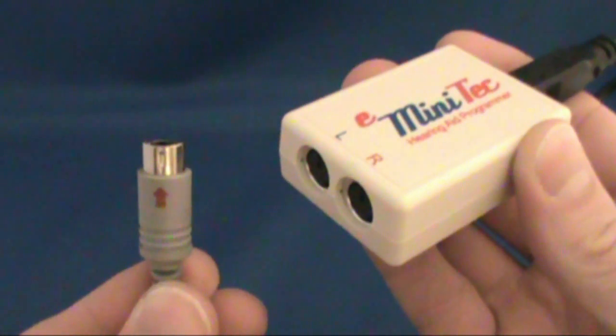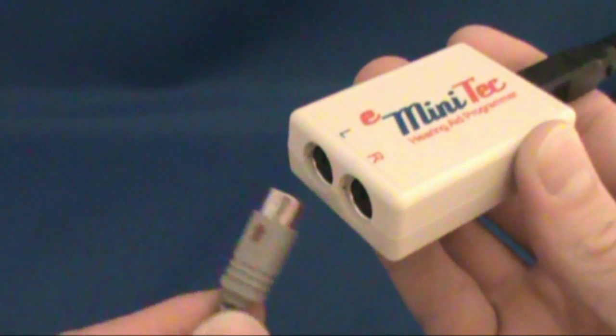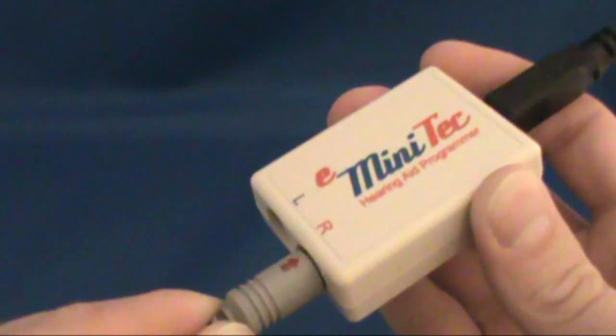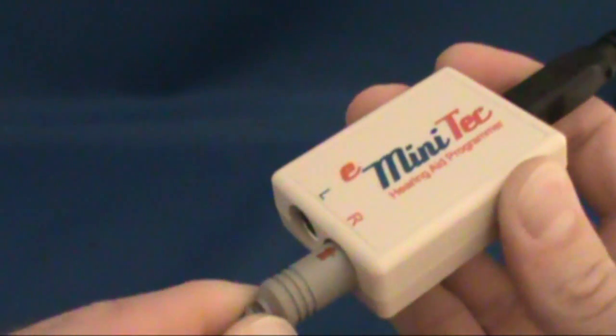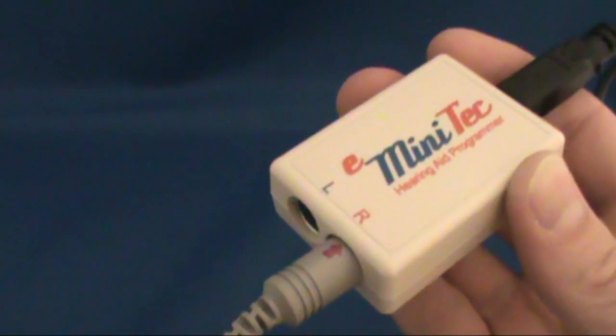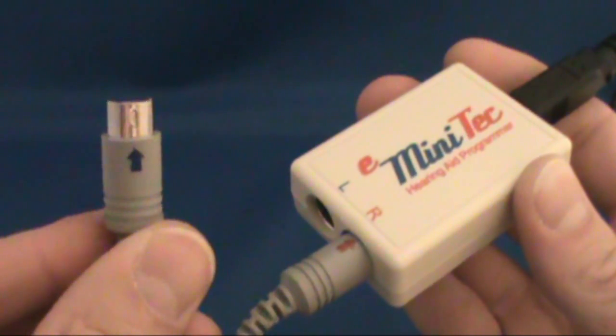Next we will connect the hearing aid programming cables to the e-minitech. The e-minitech has two ports. One is marked with a red R for the right hearing aid, and the other is marked with a blue L for the left ear hearing aid.